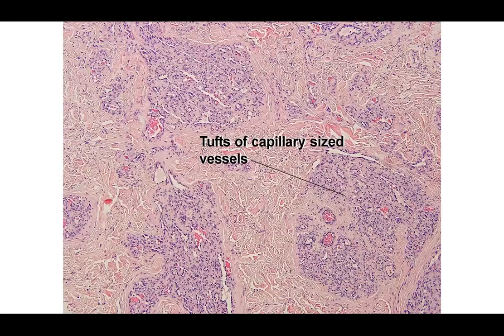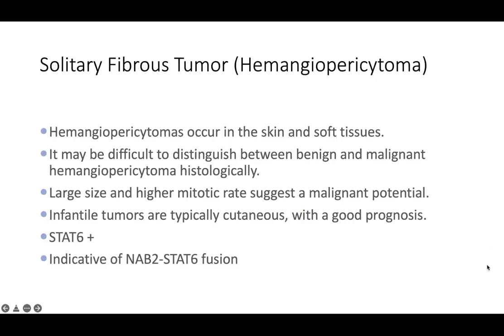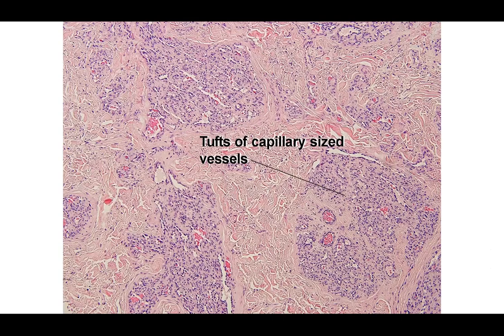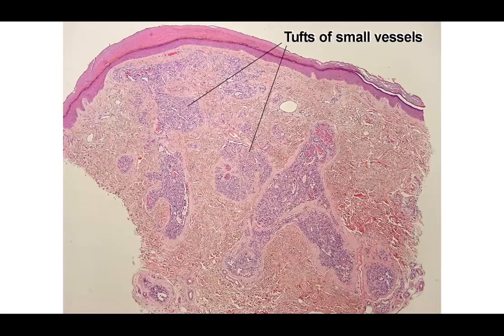At higher power you can see the tufts of capillary-sized vessels. These are so well-circumscribed that if a tufted angioma is in your answer choices, you should select it. The distribution is not the same as the lobular pattern of a lobular capillary hemangioma, and there is no collarette — which would also argue against a lobular capillary hemangioma.